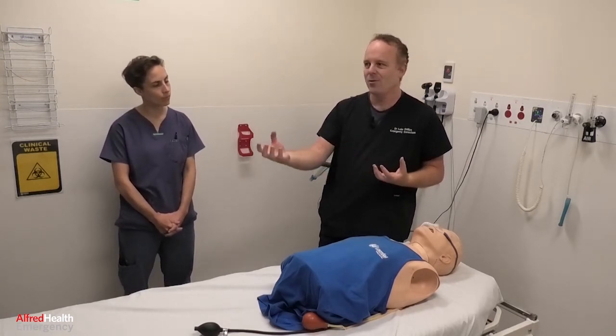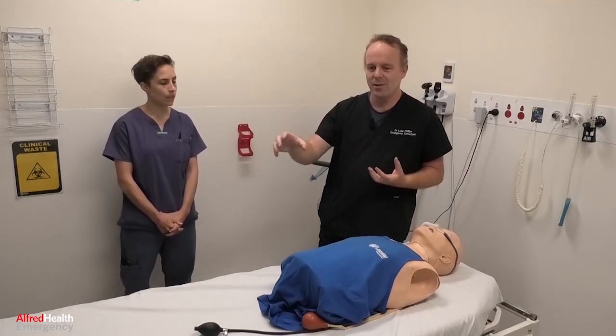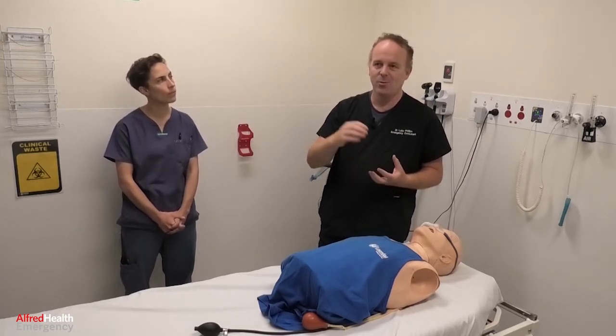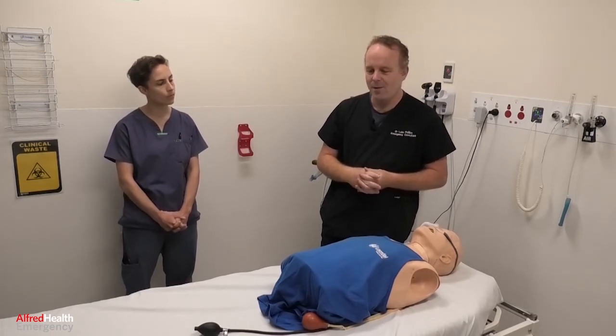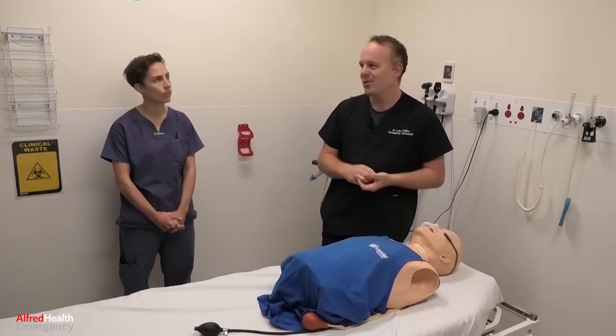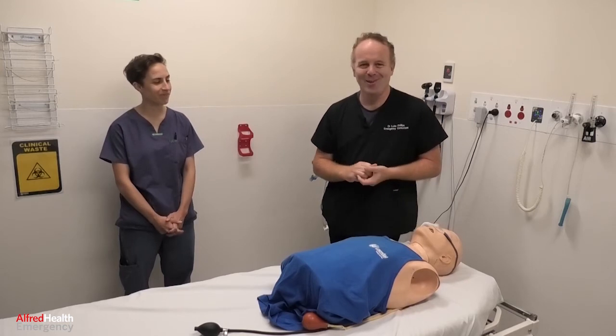When you come into the room after you've been outside and set up your equipment, it's important to let the airway nurse know what the plan is going to be. So your plan A, B, C, and D. You don't need to go through the whole checklist again. That airway nurse shouldn't be someone learning how to do an airway for the first time, is what we've said. We've got a couple of educators in here as well, so they're all on board with that.